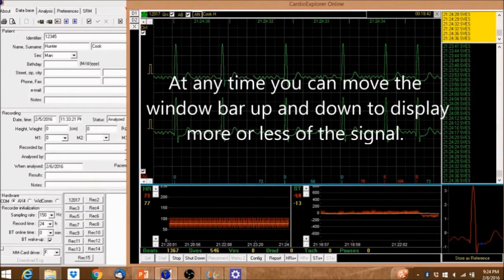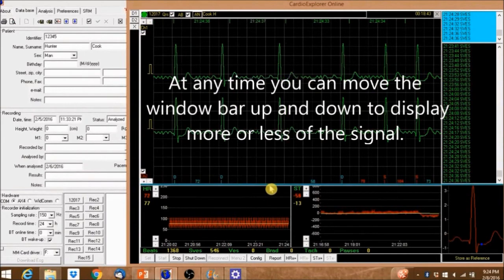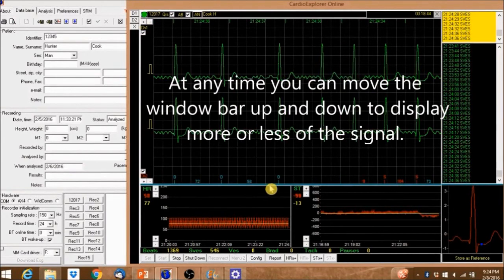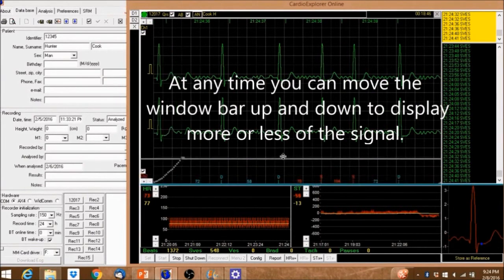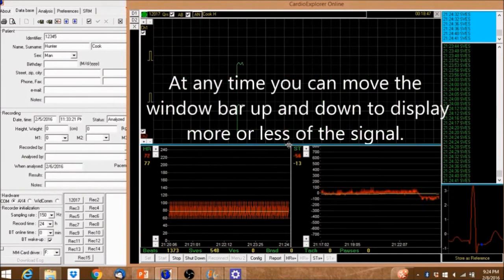At any time, you can move the window bar up and down to display more or less of the signal.